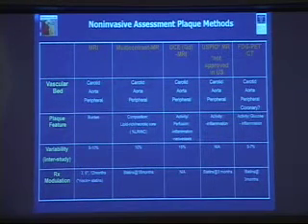Okay, so now this is a quick summary, and I will really not go in depth into it because some of it will be covered by the next speaker. But there are several versions, if you will, of MRI. There is a plain old MRI, which is focused on anatomy, and it's non-contrast enhanced. So you can actually manipulate the spins to get contrast from MRI and tissue characterization.